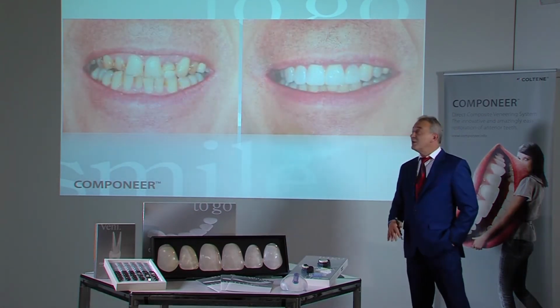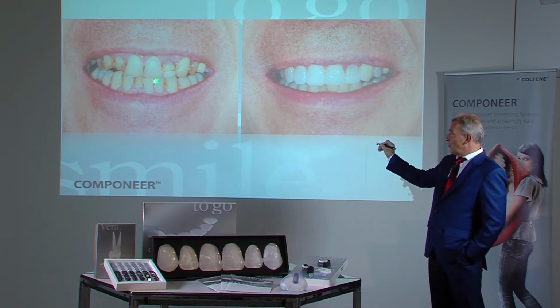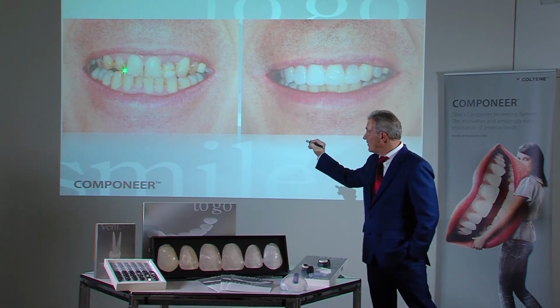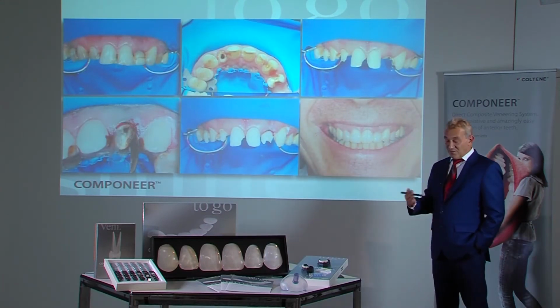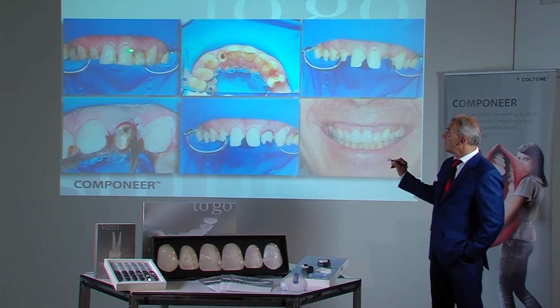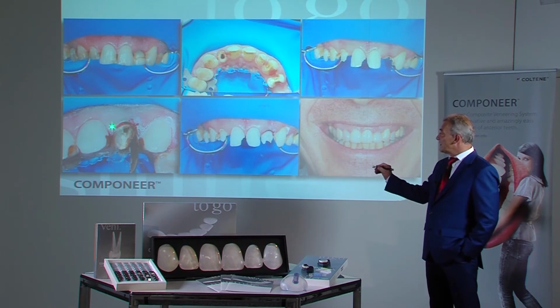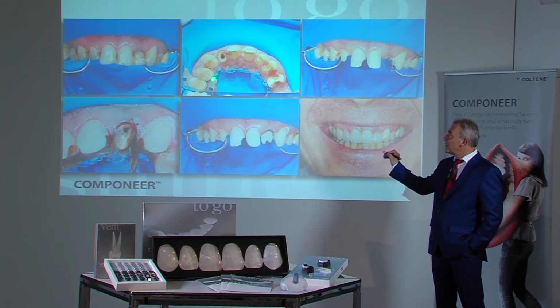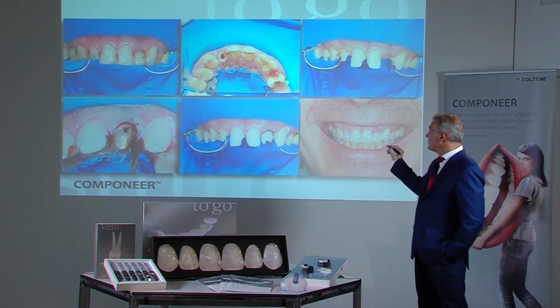Things become more difficult, of course, when things are no longer right from a multifactorial point of view. Here we have erosions at the incisal edges, old restorations and extremely extensive restorations. Despite crossbite, the patient wishes for a more attractive appearance. At the same time, we can also see devitalized teeth. The lateral too is severely damaged up to cervical. It was decided to use a post for build-up and create a core. One can see how many of the teeth have been destroyed. There's virtually nothing left, and at the back we can also see a gap.